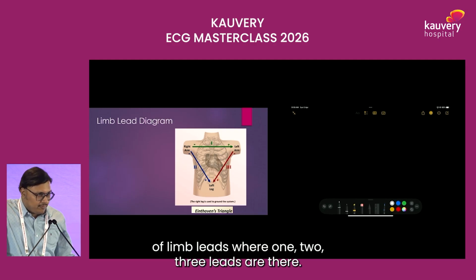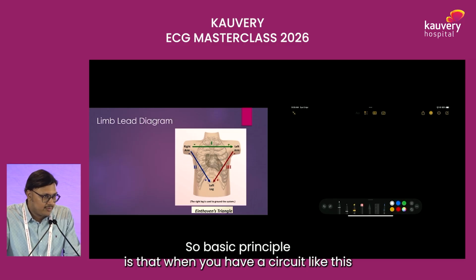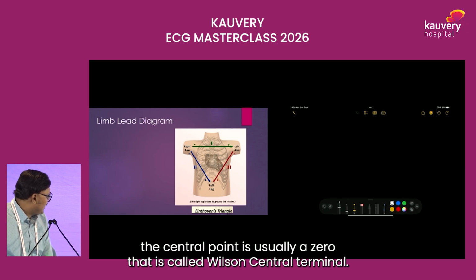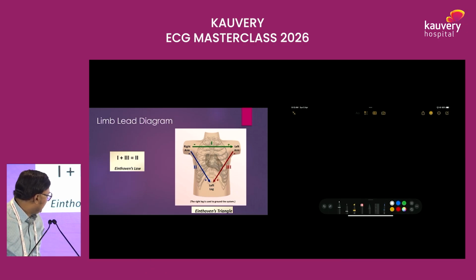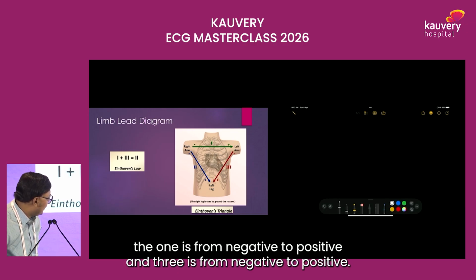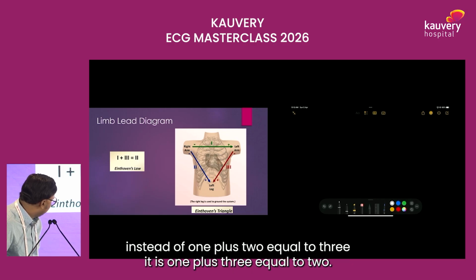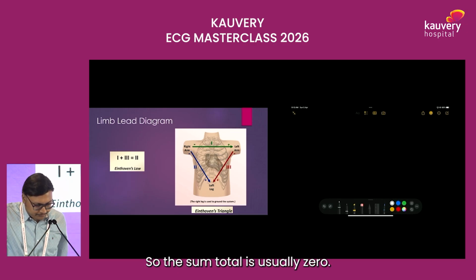So this system of limb leads, where leads 1, 2, 3 are there, is called Einthoven's triangle. The basic principle is that when you have a circuit like this, the central point is usually 0. That is called Wilson's central terminal. And Einthoven's law states that when you add the limb leads as per the polarity, it gives a 0 voltage. So basically, it comes out as 1 plus 3 equals 2, because here lead 1 is from negative to positive and lead 3 is from negative to positive. That's why instead of 1 plus 2 equals 3, it is 1 plus 3 equals 2. So the sum total is usually 0.